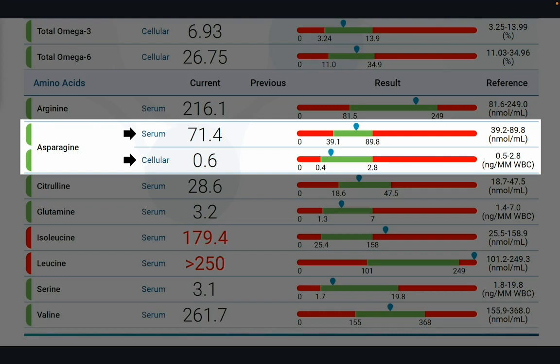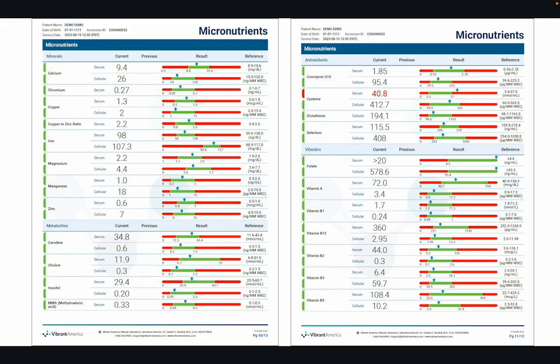Scrolling down to the amino acid section, we see that asparagine has two values: one reflecting the serum level and the other reflecting the intracellular level. Continuing to scroll, you can get insight on both serum and intracellular levels of most minerals, metabolites, antioxidants, and vitamins.